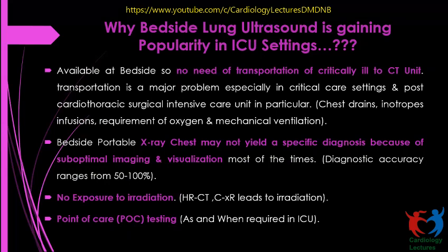So it usually leads to suboptimal imaging and visualization, and the diagnostic accuracy of the portable X-ray in the ICU ranges from 50 to 100%, so it is again not a very good tool for diagnosing lung conditions.